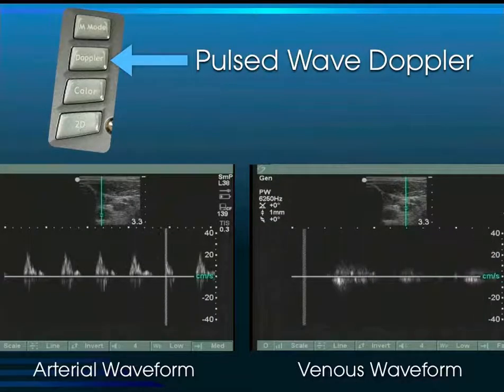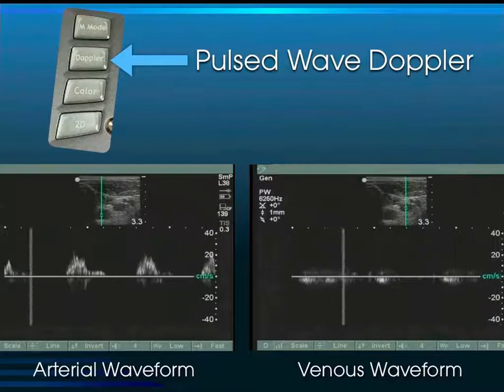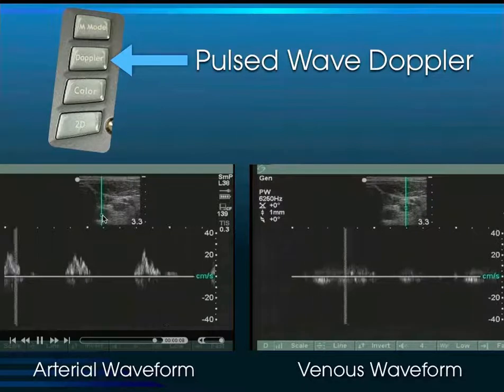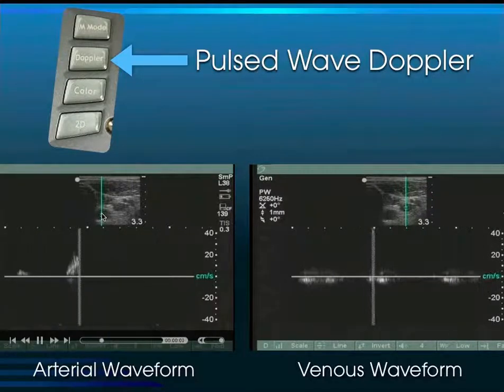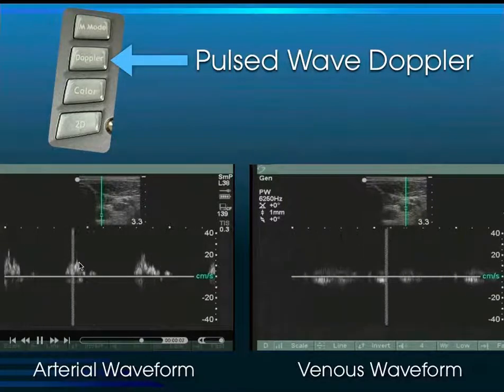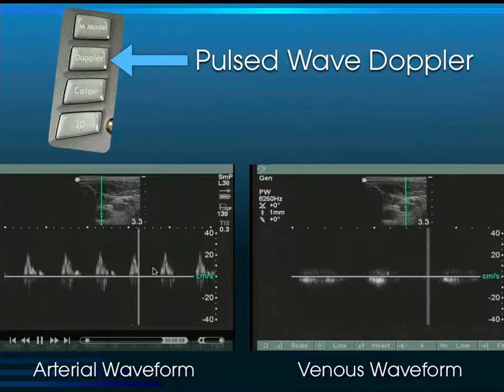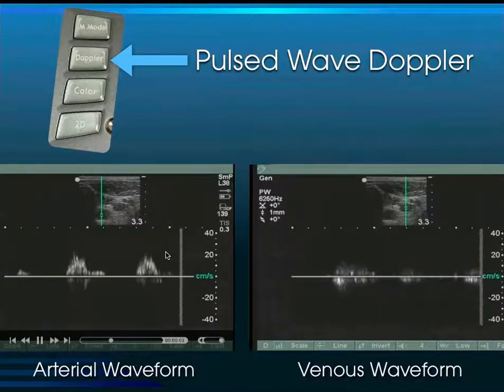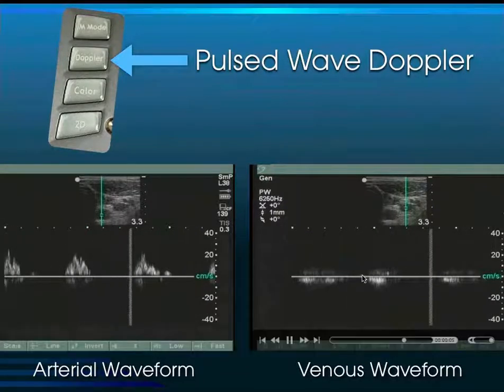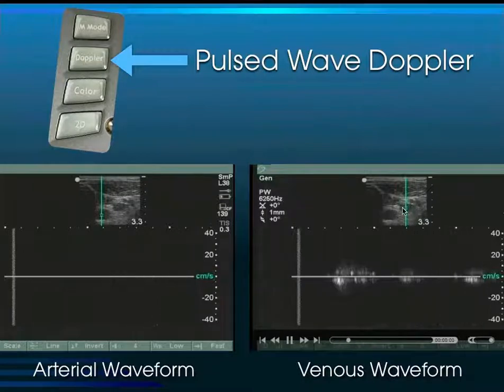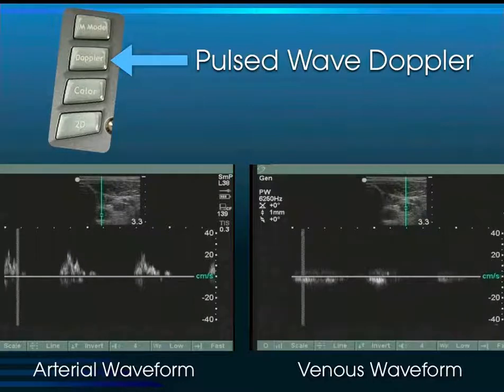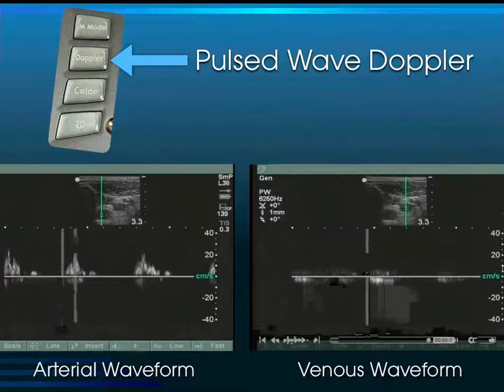Then there's pulsed wave Doppler, sometimes called spectral Doppler. After depressing the Doppler button you get a sampling gate, and you can direct where you want that sampling gate. In this case it's over the subclavian artery, giving an arterial waveform. These are called velocity waveforms — the peak of this spike corresponds to 20 centimeters per second. Over here, the subclavian vein appears as a much lower flow state, up to approximately 10 centimeters per second.